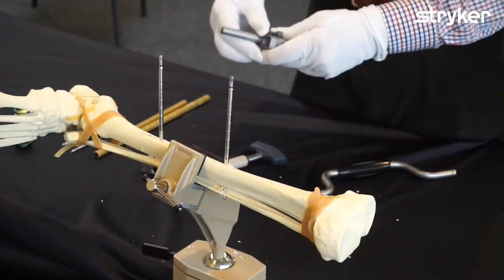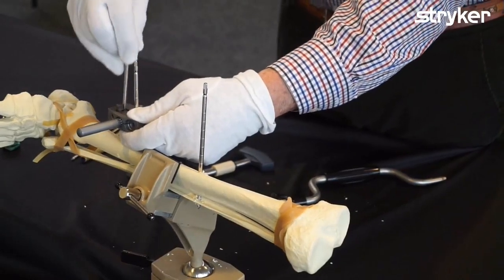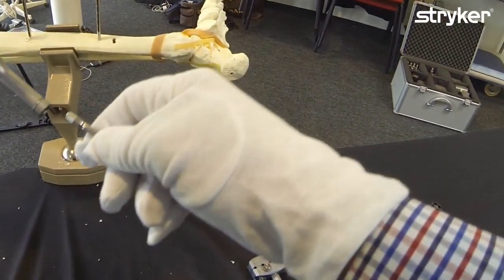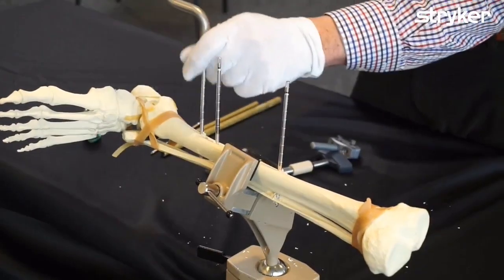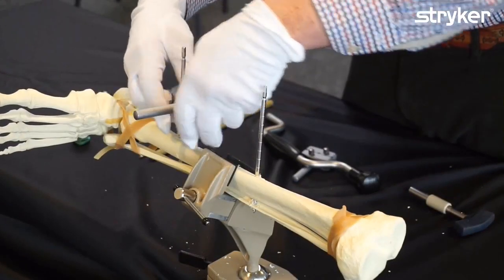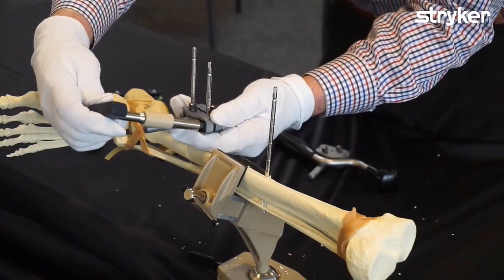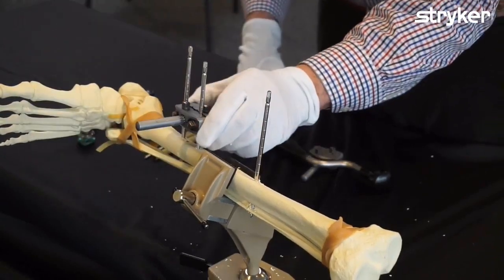Now we're going to make a pin group — put this on the bone. I mark the skin so I know where that mark is. I'm going to put the second pin in as parallel as possible to the first pin. Then I slide the pin holding clamp over the pin, about a finger breadth there. When you tighten the pin, you always hold the clamp and tighten so that you don't twist the pin in the bone — one side a little bit, then the other side until firm. Not too firm, just firm enough. That's one pin group.